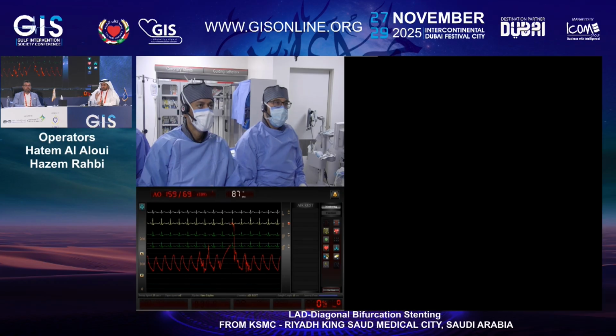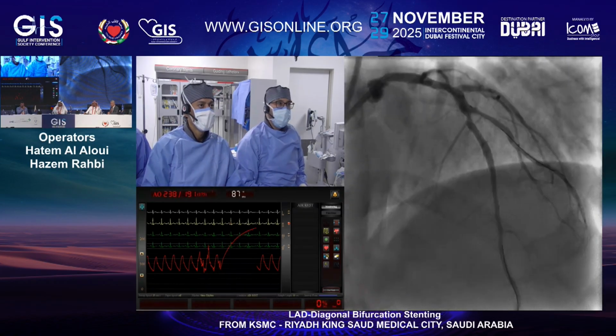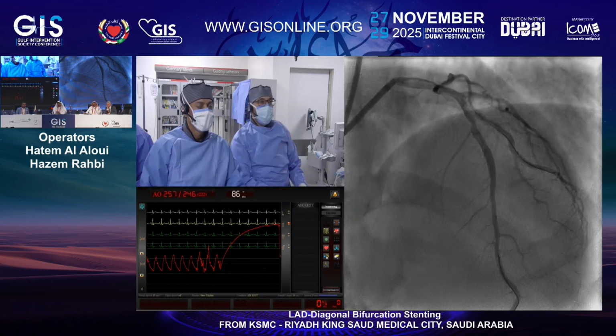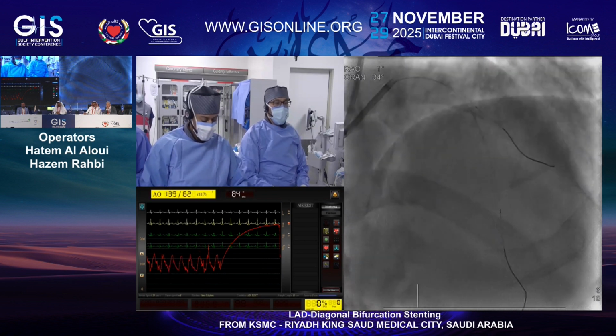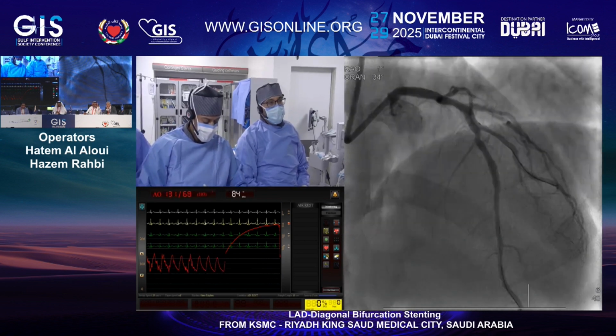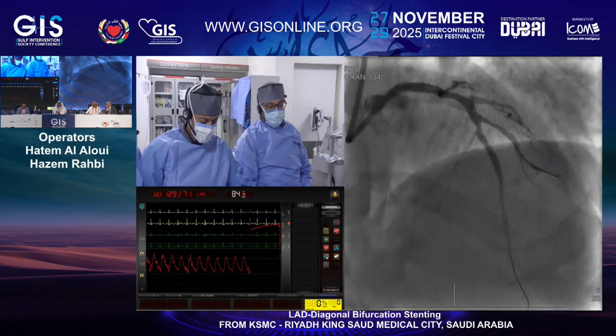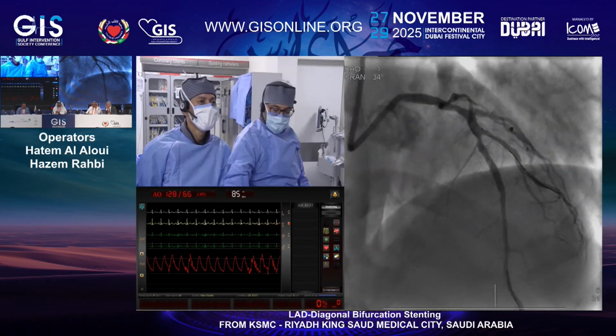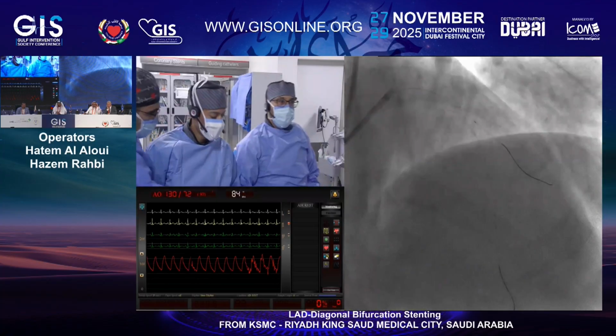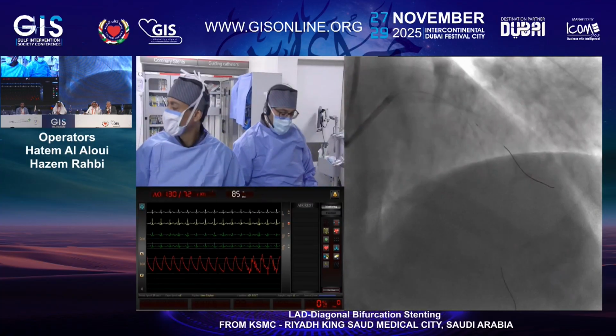Go ahead. I think we still have some work to do on the diagonal. What do you think? Dr. Wael from the panelists suggested that after the cutting balloon, you use a 3.0 NC balloon. I agree. So let's take 3.0 by 15, please.